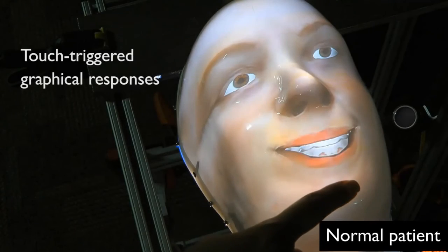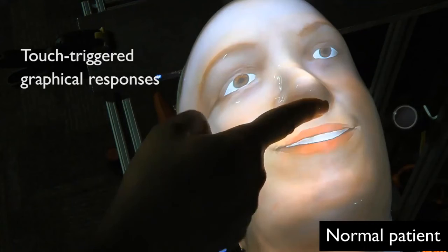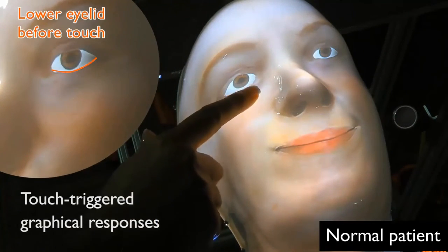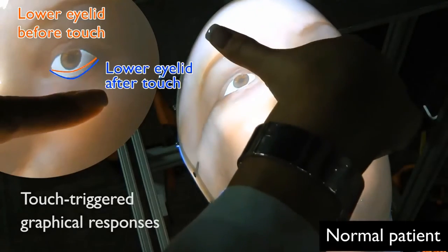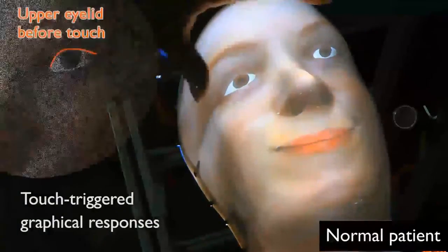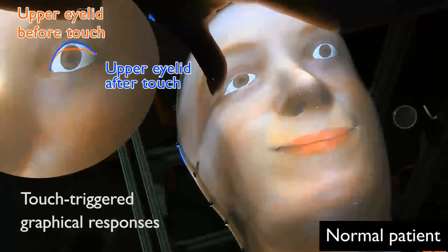Along with another PhD student, we developed methods to automate touch interactions on a physical virtual patient head. For example, the user can touch the lips and/or the eyelids. We are working on using the same technology on the full physical virtual patient bed.